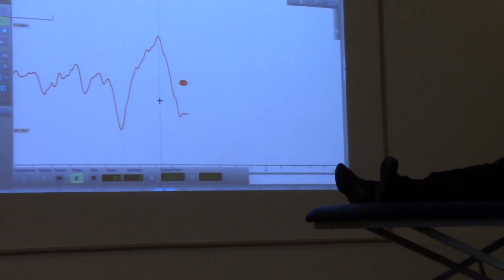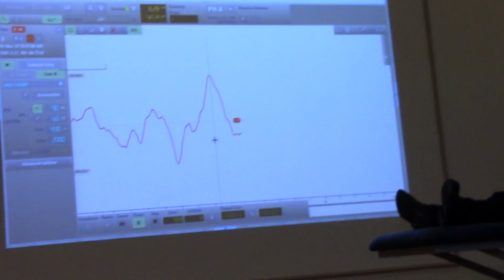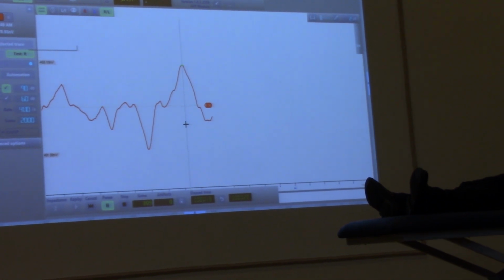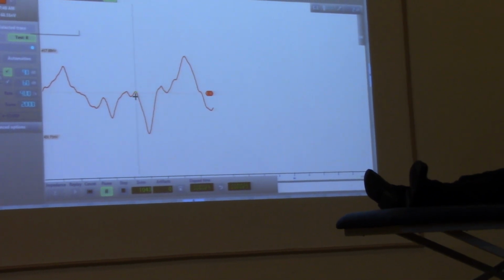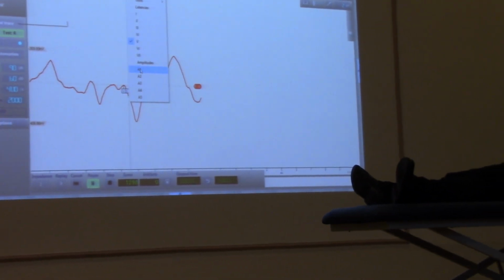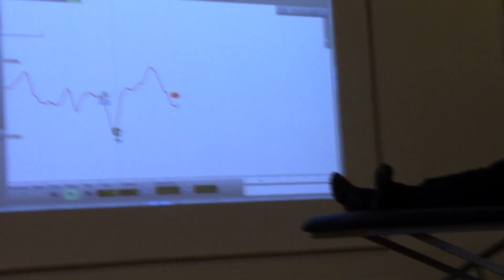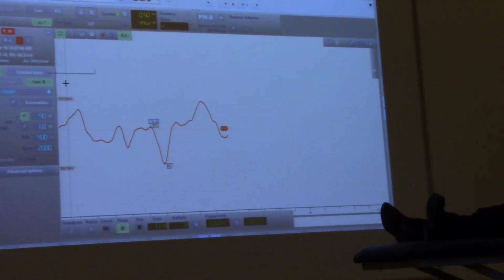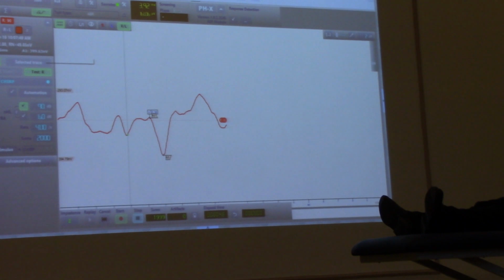This is another example of stimulus. It's the chirp. As you can see, the structure of the ABR is different. Okay, it's normal. What we can see, with respect to before, now we will measure, is a fifth peak that is quite bigger and stable. We have 400 nanovolts approximately on the fifth peak.